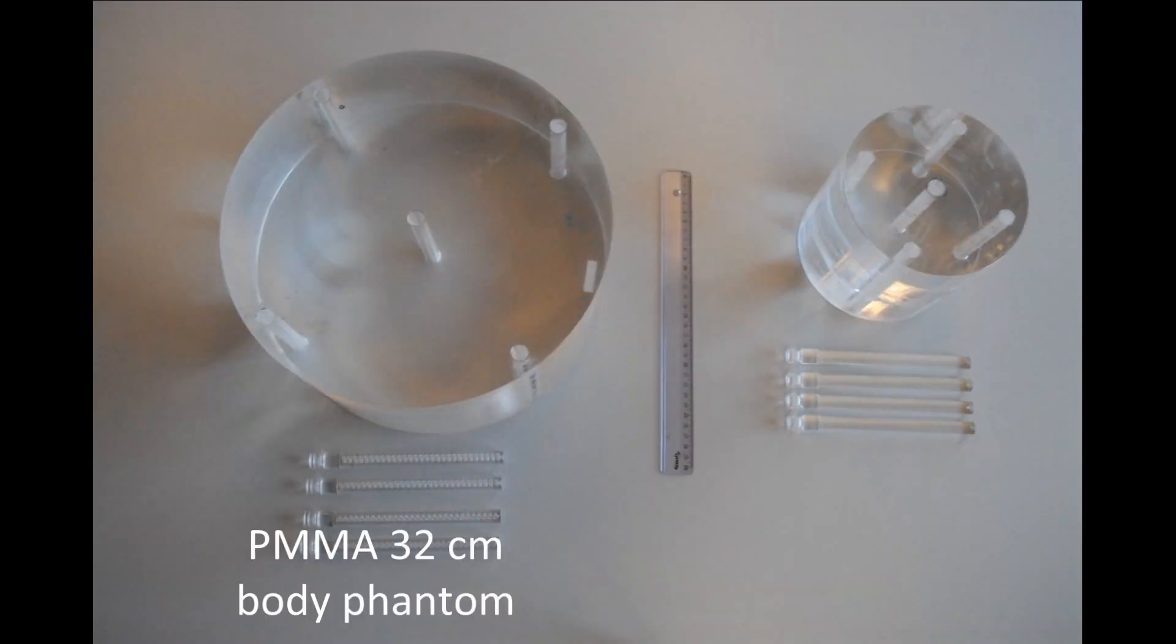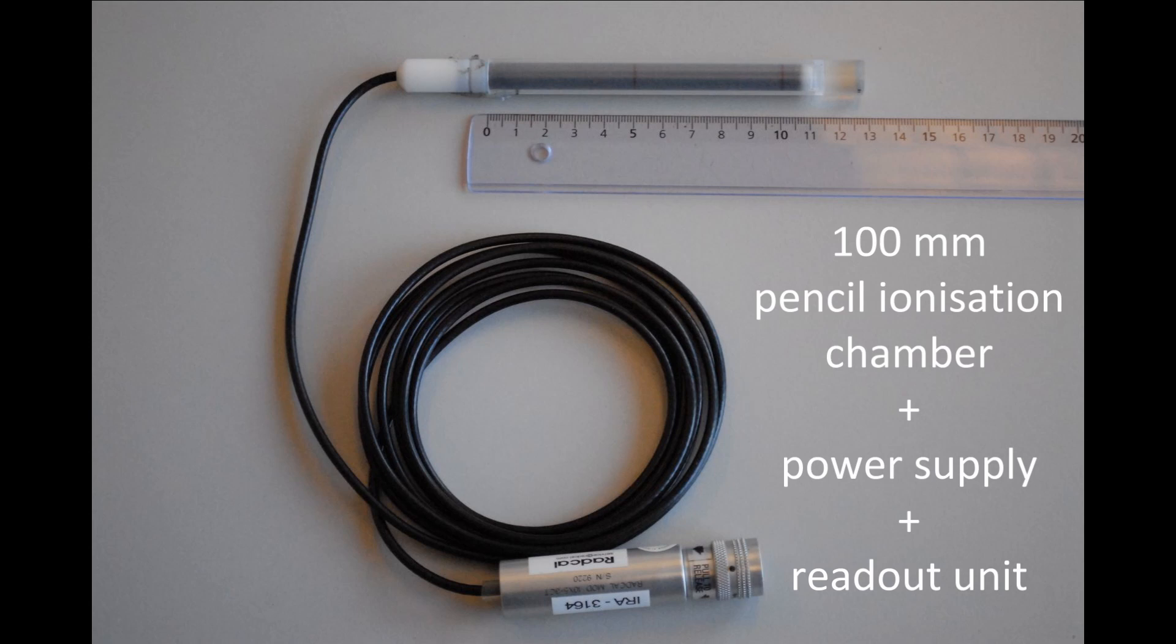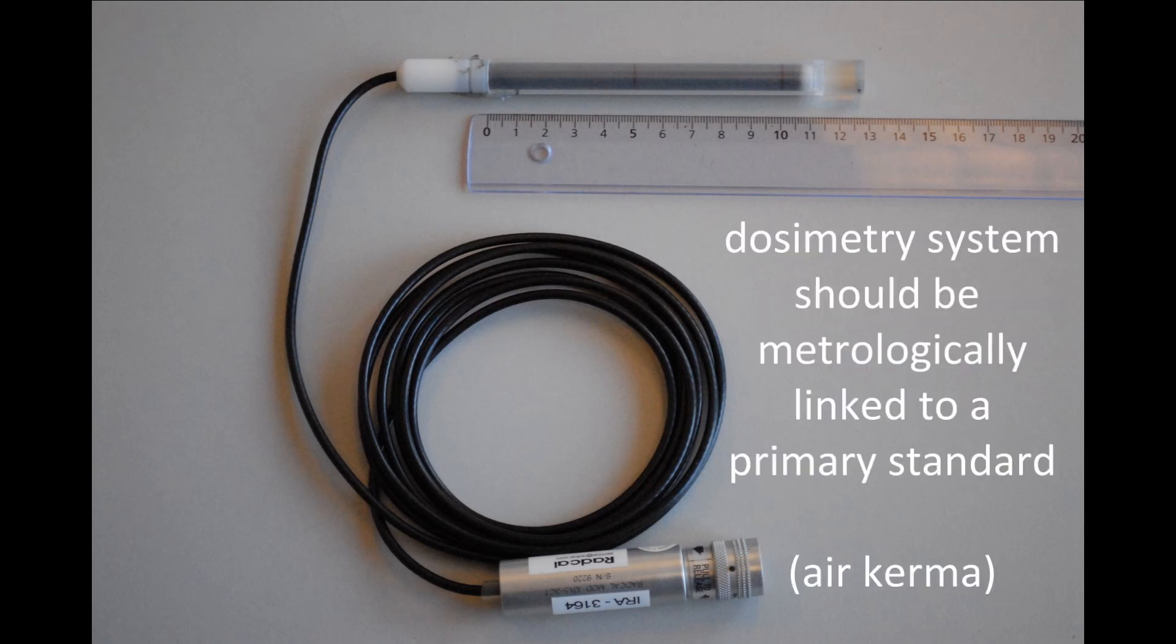You will need a 32 centimeter diameter PMMA body phantom and a 16 centimeter diameter PMMA head phantom. You will also need a 100 millimeter pencil ionization chamber, its power supply and readout unit. Make sure your measurements are traceable to a primary standard.